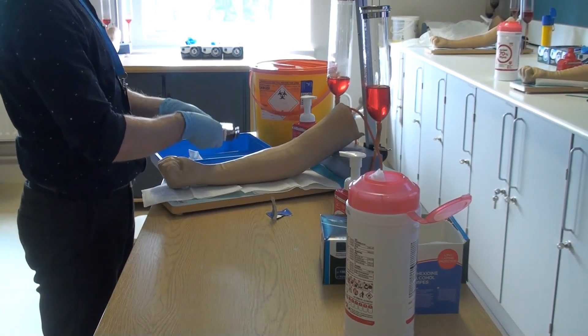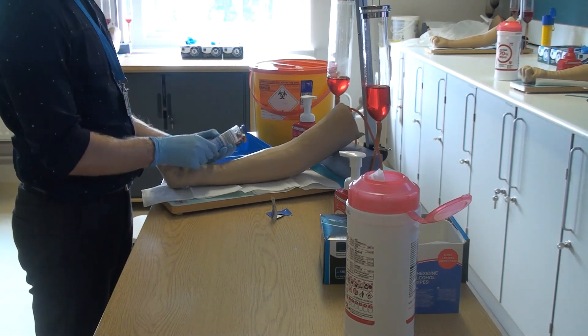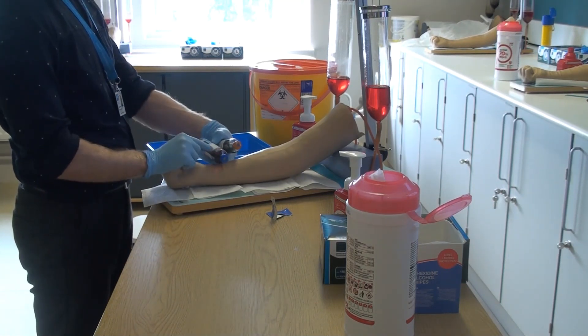Invert the bottles two to three times but do not shake, and check the patient's demographics and label at the bedside with the correct information.